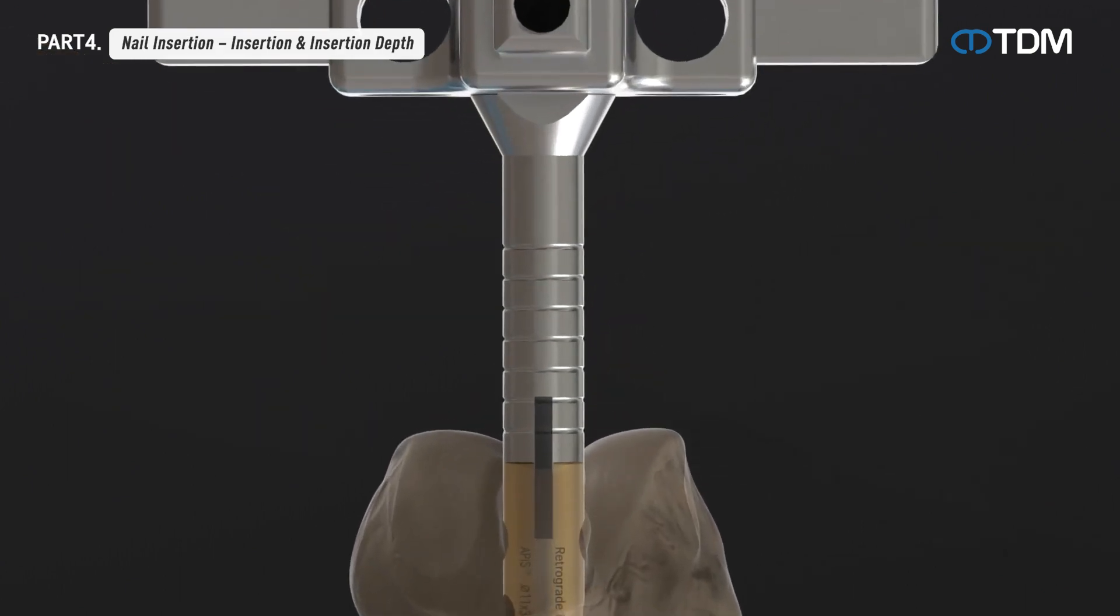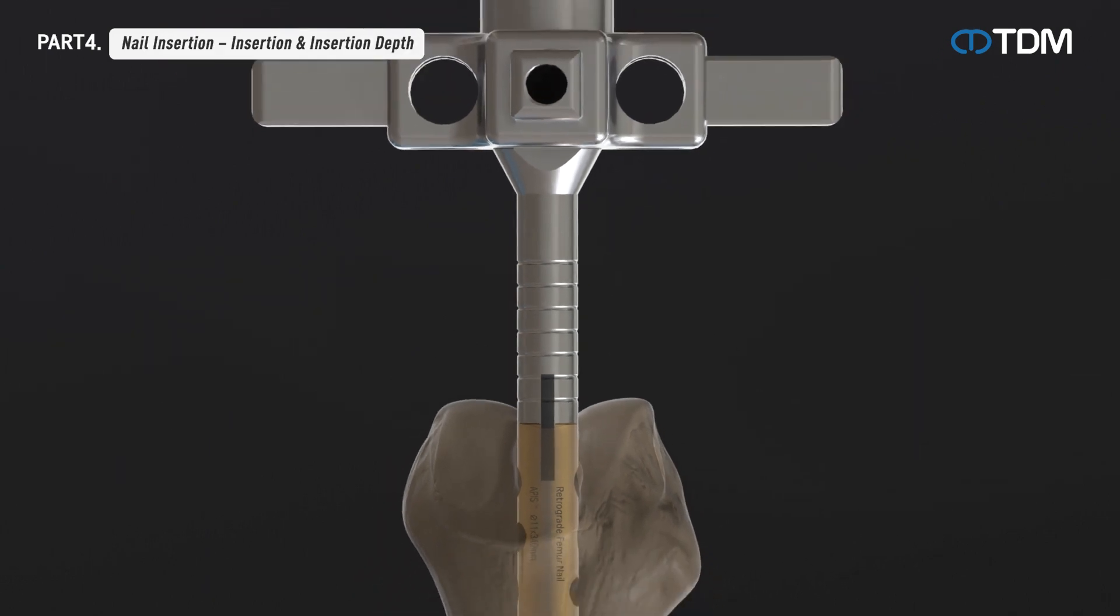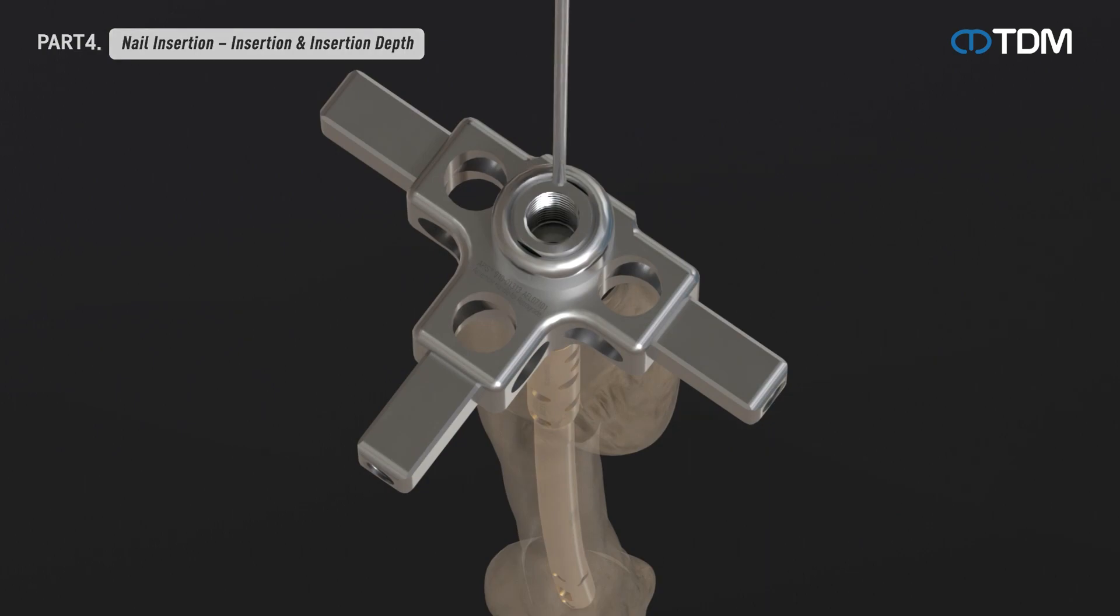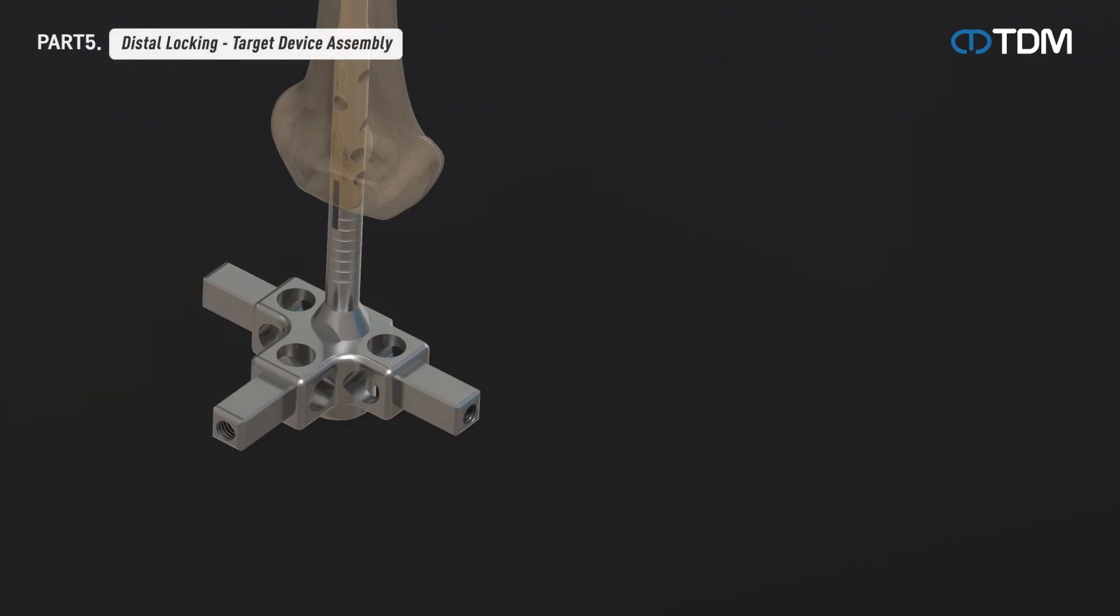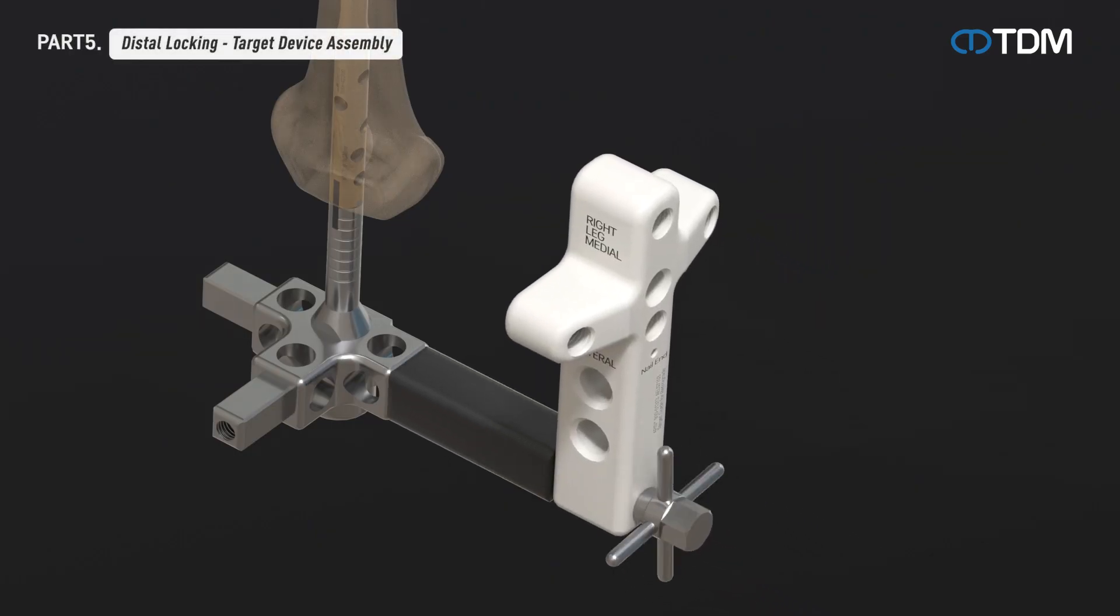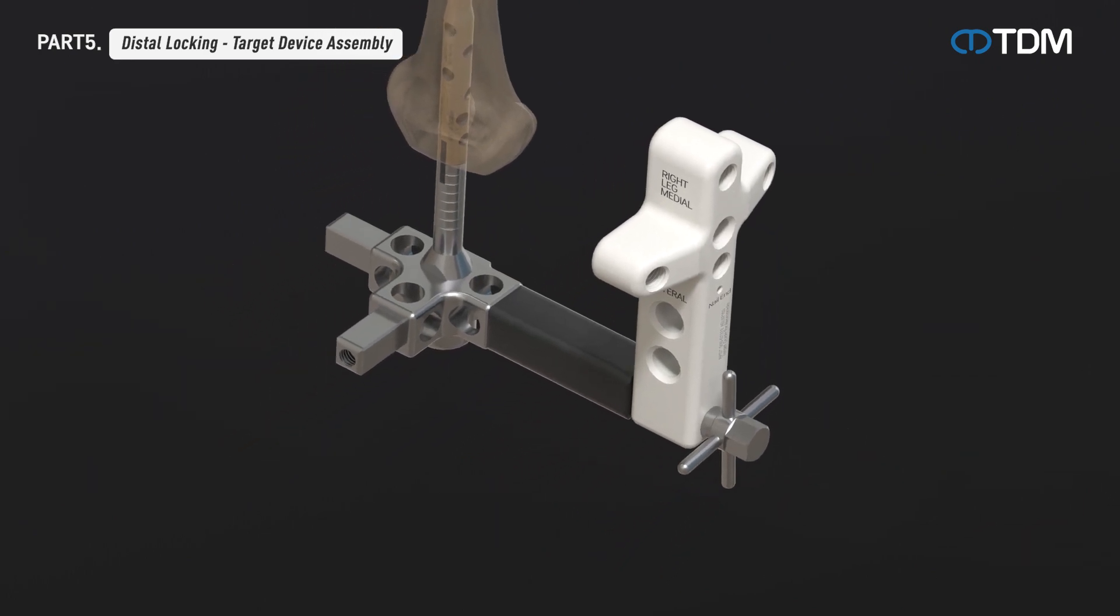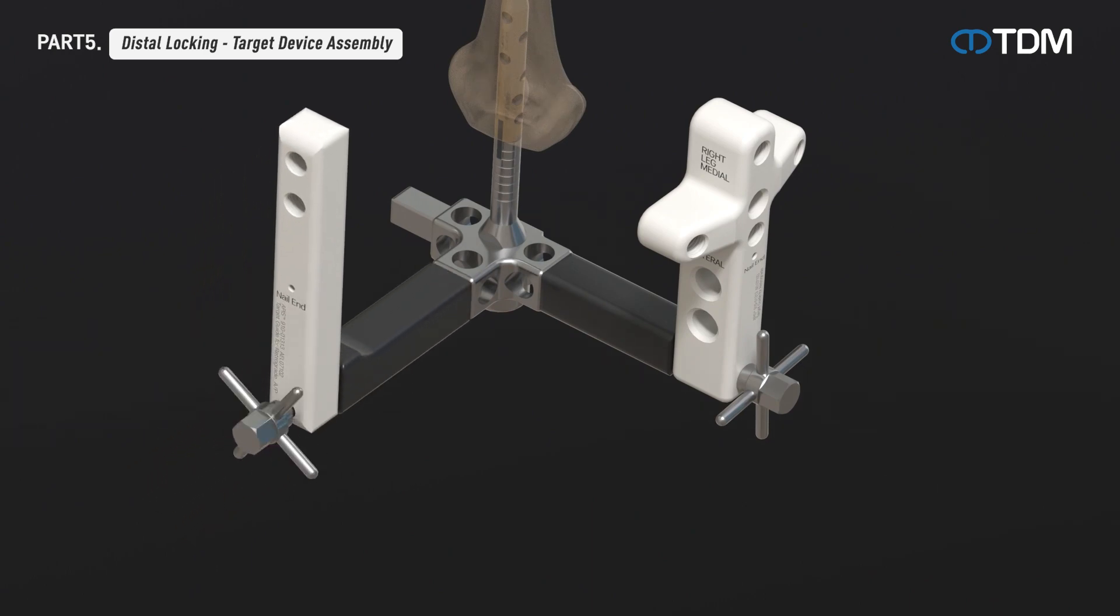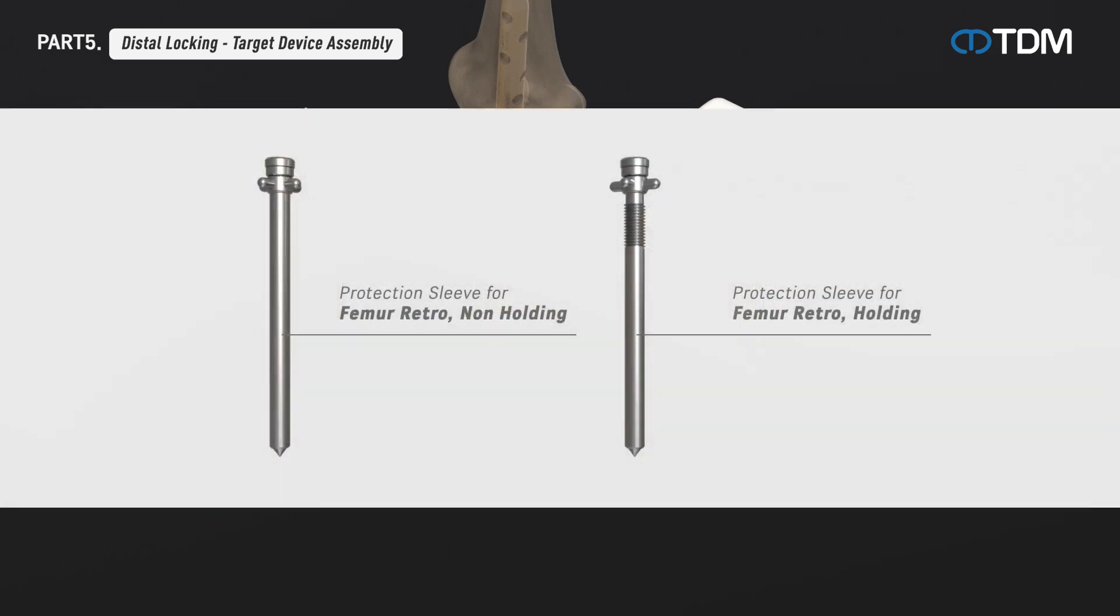Check the nail endpoints with the barrel gauge of the assembly handle marked five millimeters apart. When the insertion is complete, remove the reaming rod. Attach the target guide to the assembly handle combined with the nail. Insert the guide pin into the nail endpoint targeting, align it with the end of the nail, and check the depth. Additional anterior target guide can be assembled as required.